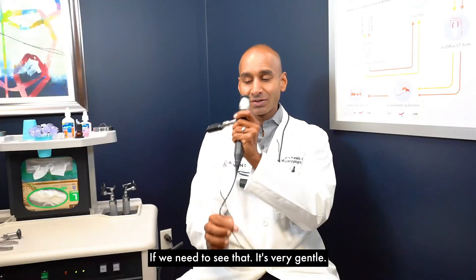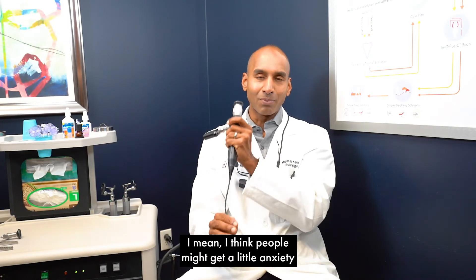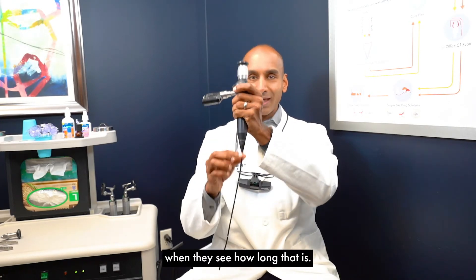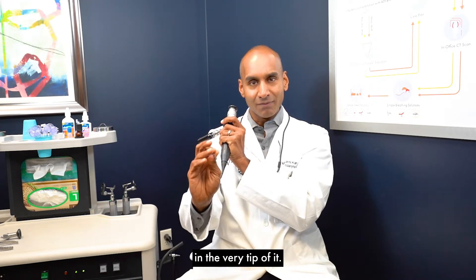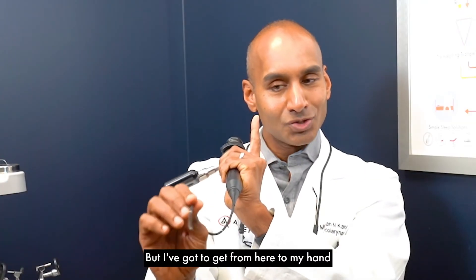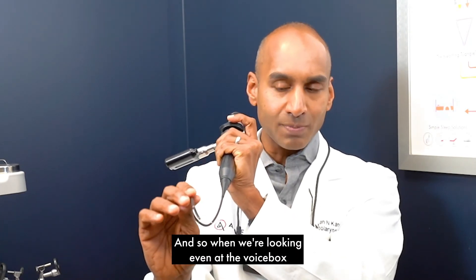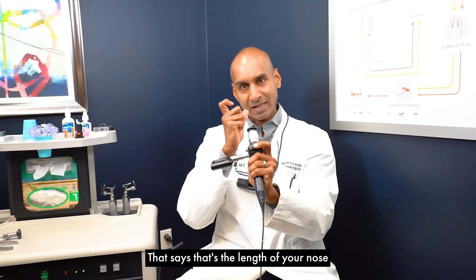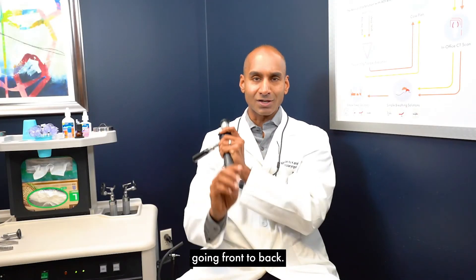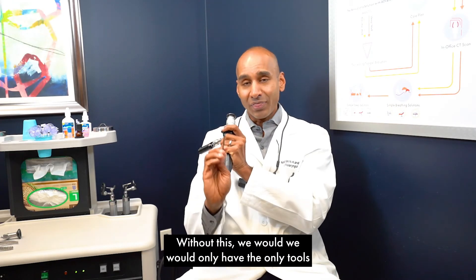This instrument is very gentle. People might get a little anxious when they see how long it is, but the reason it's that long is we're typically only inserting the very tip — I've got to get from the eyepiece to my hand and then into your nose. Even when looking at the voice box, we're only inserting it about this far, which is just the front-to-back length of your nose. So this is not a scary instrument at all.